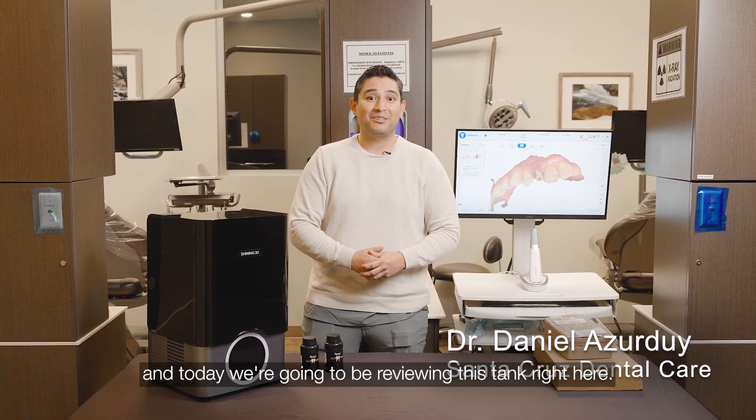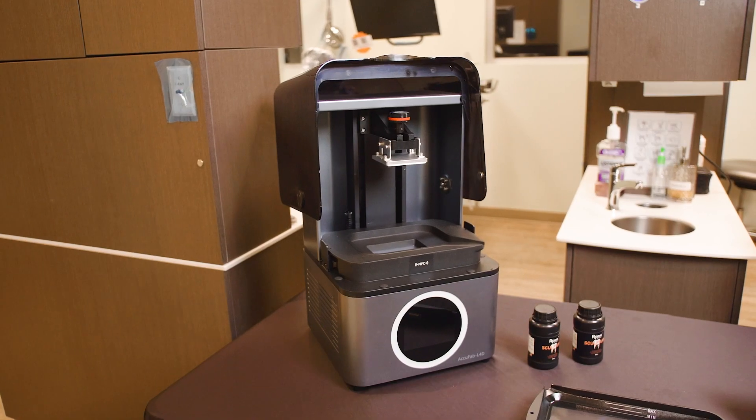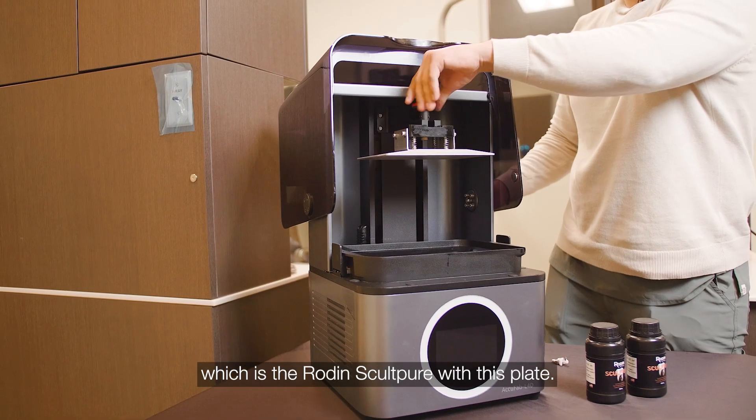Hi, this is Dr. Danny Lester Dewey and today we're going to be reviewing this tank right here. We're talking about the AccuFab L4D. It's a very robust 3D printer. The one thing I want to show is how do we print this resin, which is the rodent's culture, with this plate.